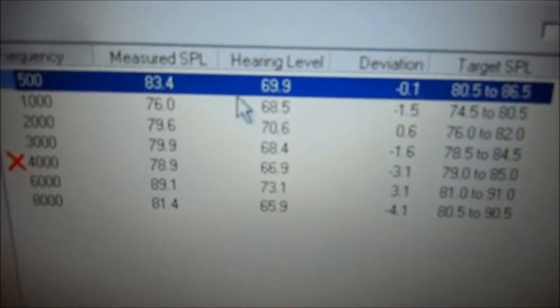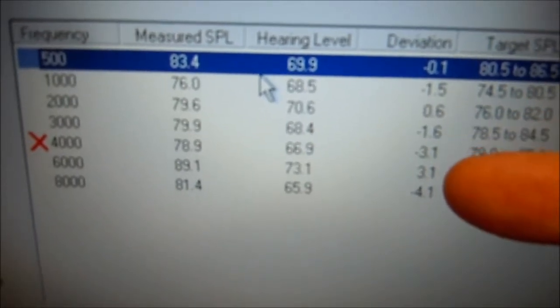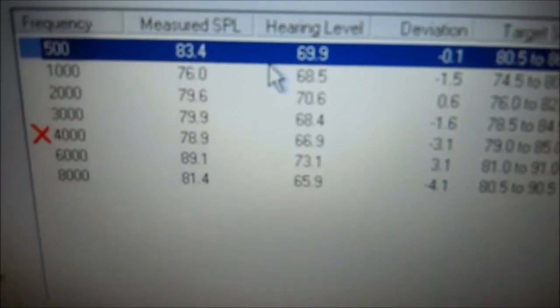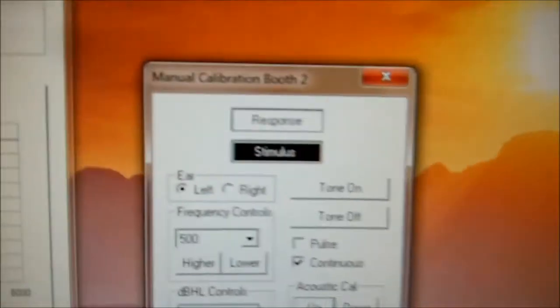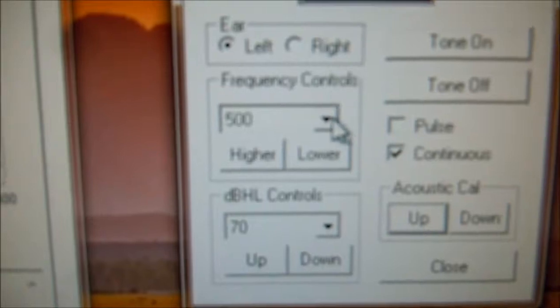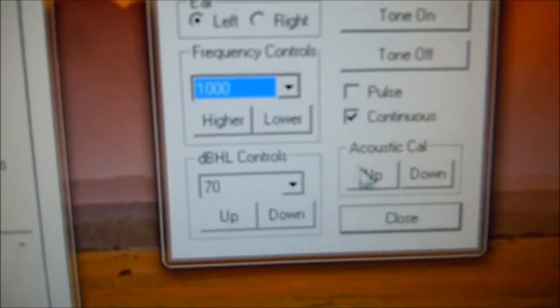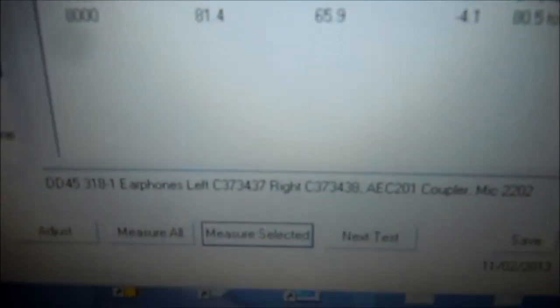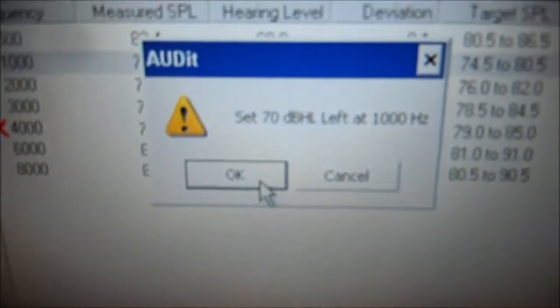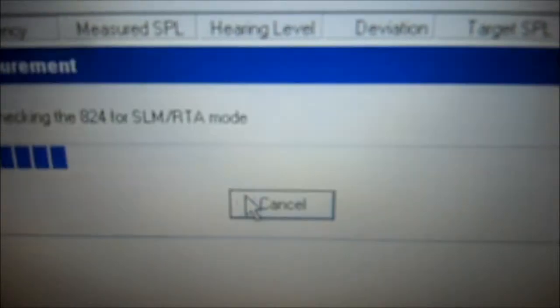So now we'll do the same for 1,000. Let's select 1,000 — it was negative 1.5. We're going to select 1,000 on the audiometer and because it was negative, we're going to go up one, just one click. Go back here, select measure selected. It says 70 dB at 1,000 Hz. Click OK.